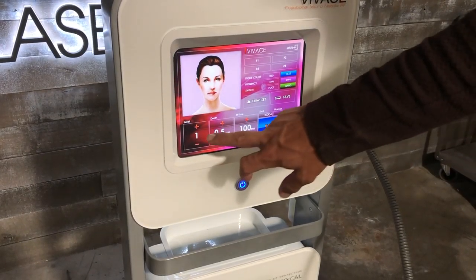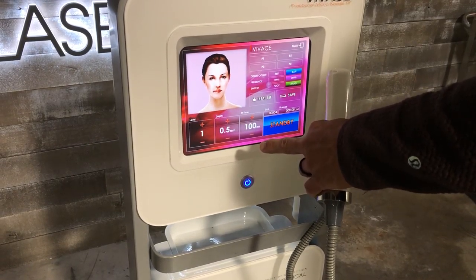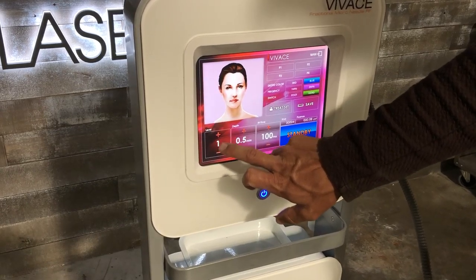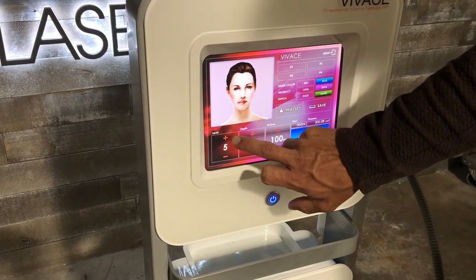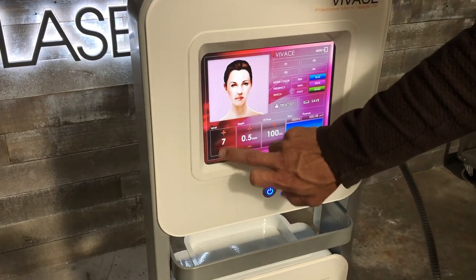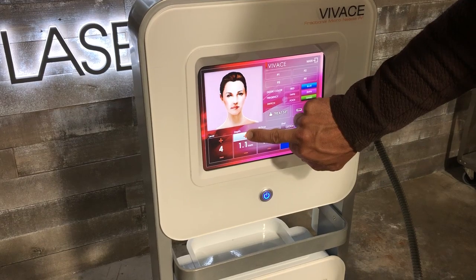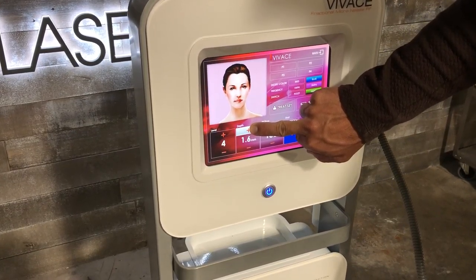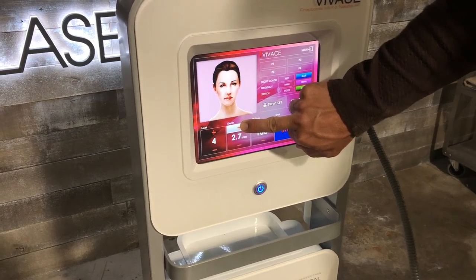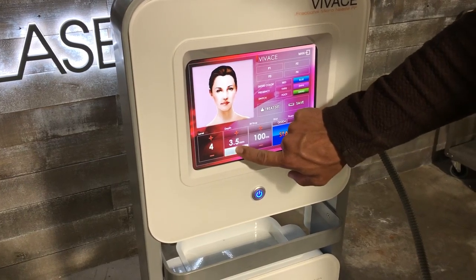You've also got levels — levels of energy, depth penetration, and time in milliseconds. This goes up to eight levels, and you can go up to three and a half on the depth. That's the max.